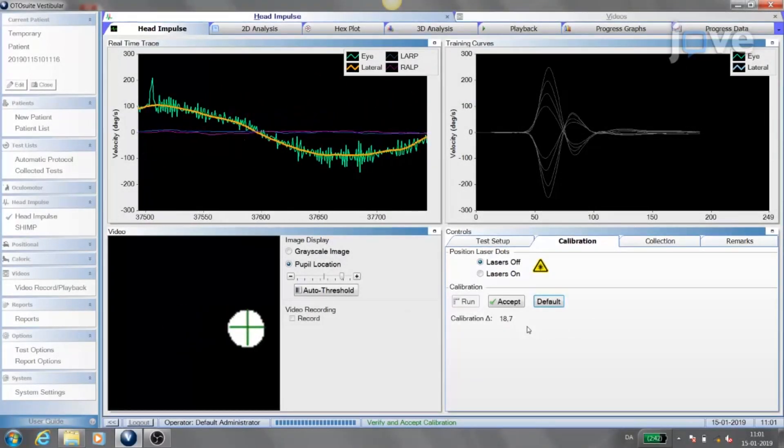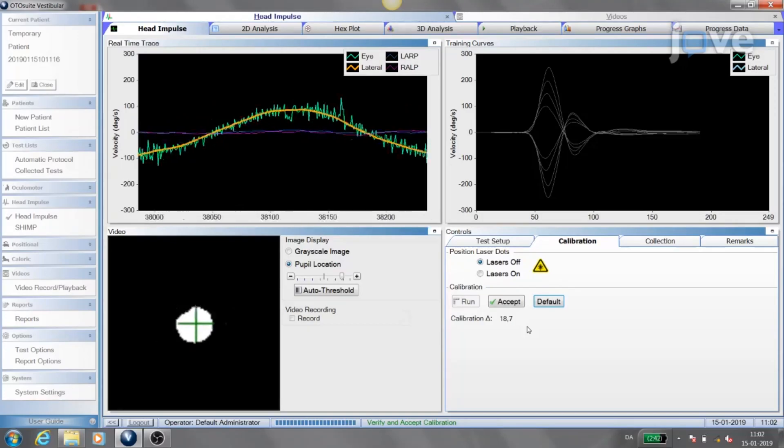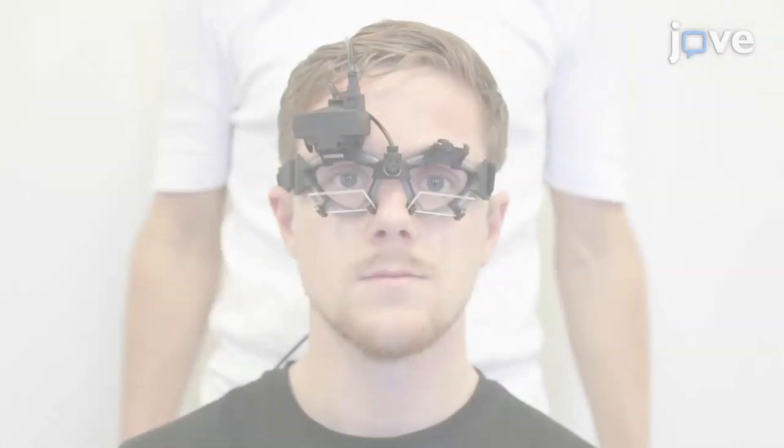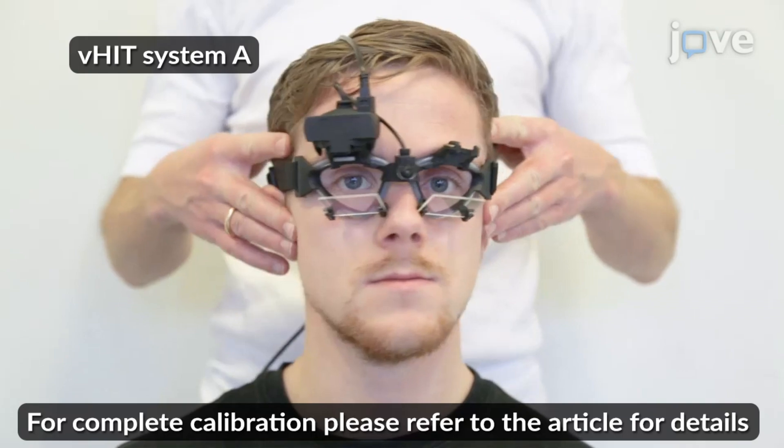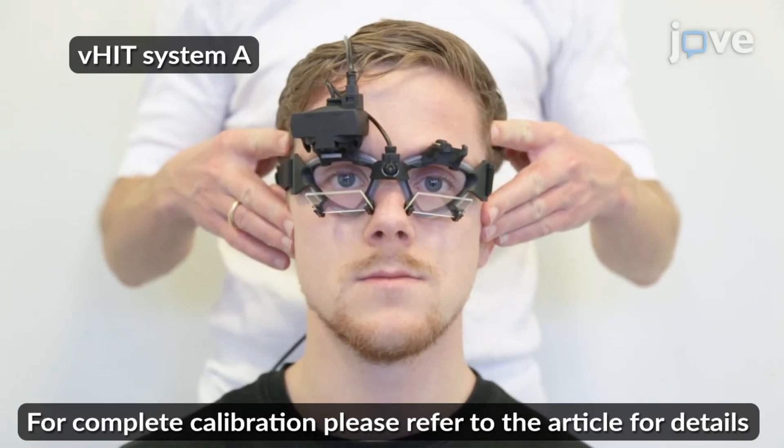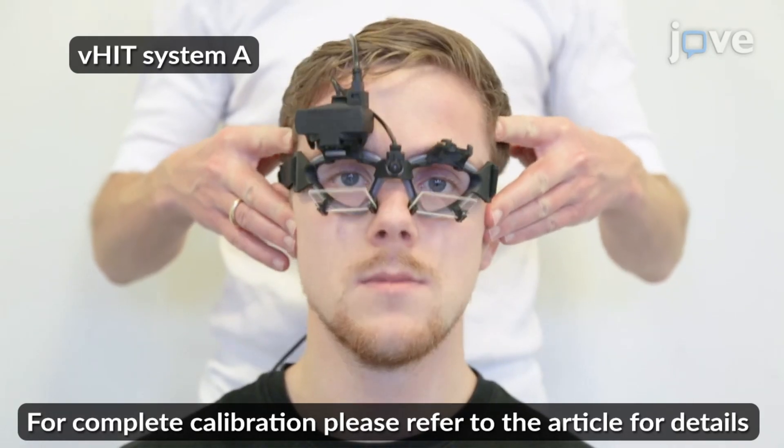Finally, check that eye and head velocities match. Calibration for VHIT system A consists of two separate calibrations, if both horizontal and vertical testing is intended.